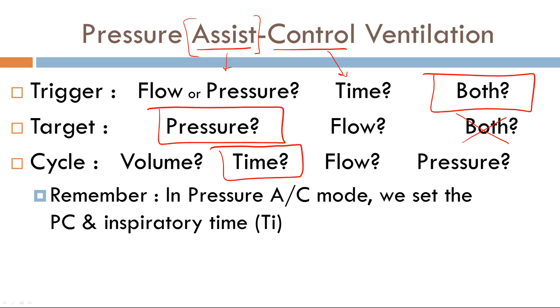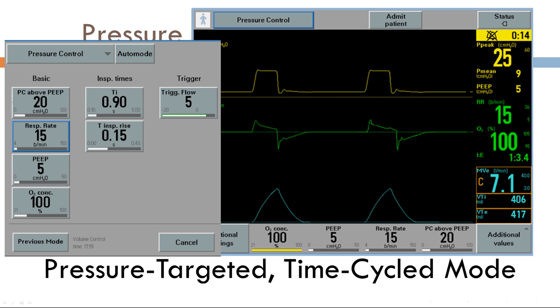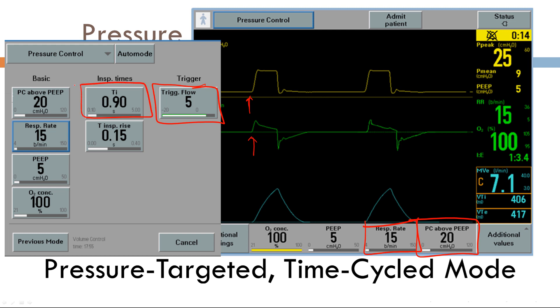In pressure AC, we set the pressure control — that's the target variable — and the inspiratory time, which is the cycle variable. Pressure assist-control ventilation is a pressure-targeted, time-cycled mode. Looking at the waveform: this controlled breath has no negative deflection and no pink line; the trigger variable is the set respiratory rate. We also have a flow trigger set at 5 L/min. The target variable is pressure (pressure control), the cycle variable is inspiratory time set at 0.9 seconds, and the baseline phase is PEEP of 5.